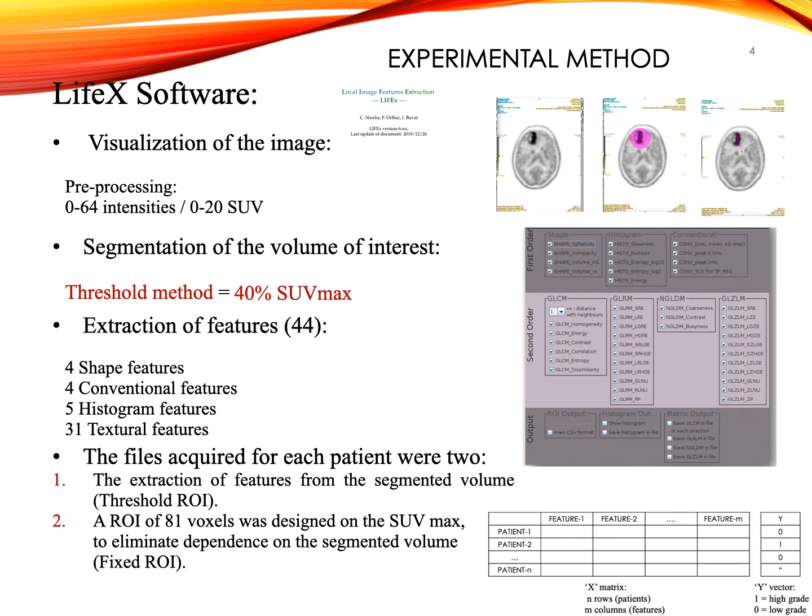Although manual delineation seems the most intuitive, it's subject to variability among observers and provides irreproducible results. An operator-independent segmentation method is required. In our study, a threshold method was applied. The user must identify the area containing the target to avoid false positives. Subsequently, the algorithm carries out the steps automatically.